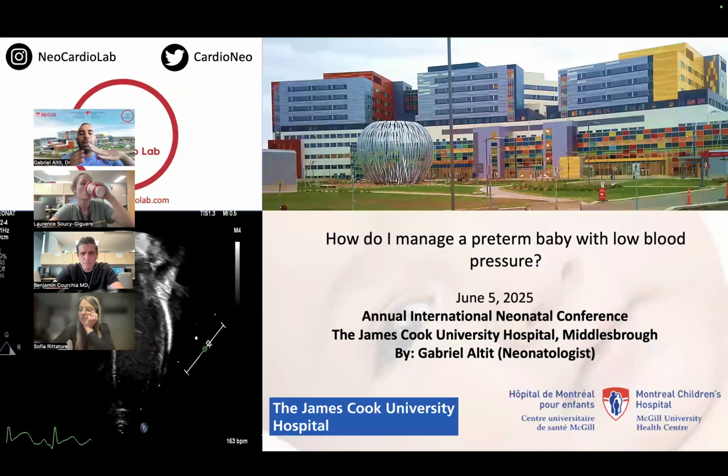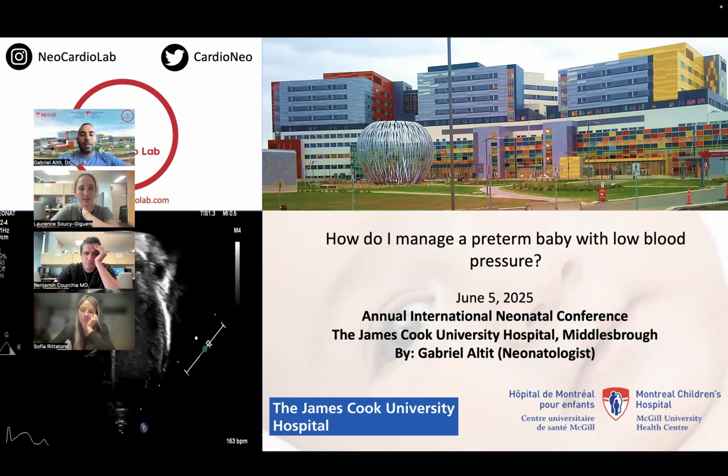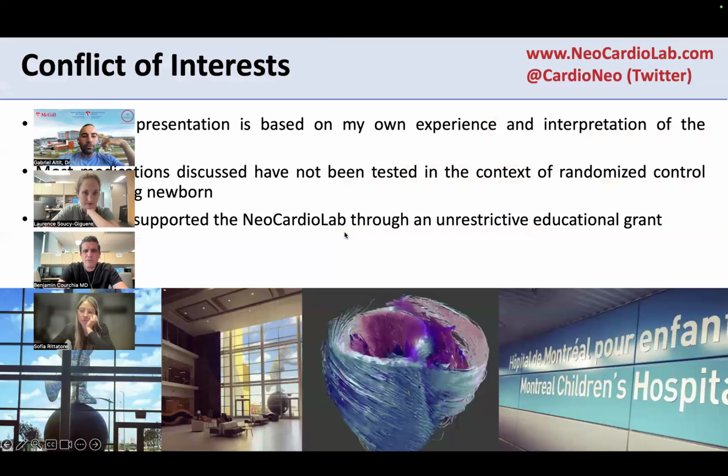So I think a lot of the core applications we do in the acute setting in TNE is to try to understand why your baby is becoming hemodynamically unstable. Of course, there's a whole component of patients who have various pulmonary hypertension phenotypes, more in the chronic phase. There are patients that may have cardiac hypertrophy. So there are definitely elements that we try to understand. But today we're going to try to deconstruct the main picture of what shock is and how it can present in the early period of life or during an acute event of decompensation.